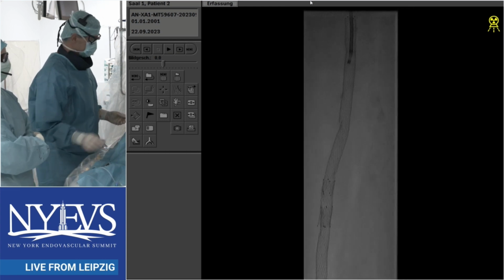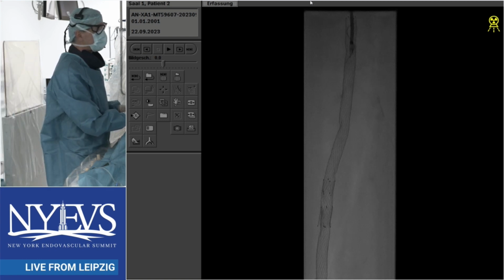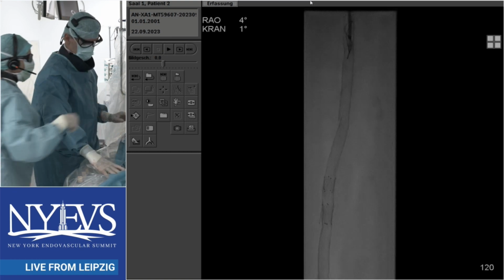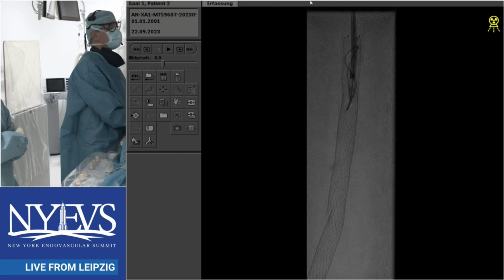Maybe I can ask the panel here. We have a classic ISR case. We've got multiple ways that we can treat ISR today. Just asking the panelists, what would be your choice here? We've got laser, we've got Rotarex, we've got other devices, we've got data for a lot of this stuff. Maybe we can start with PK and go down.